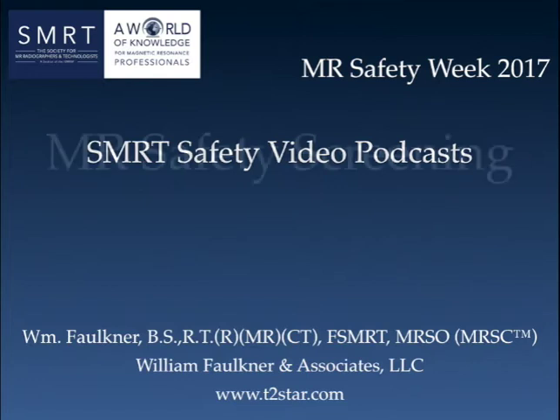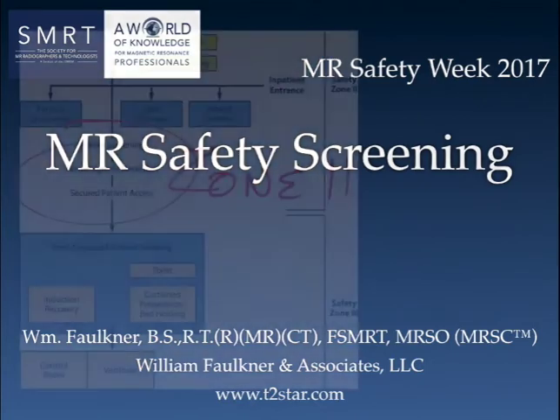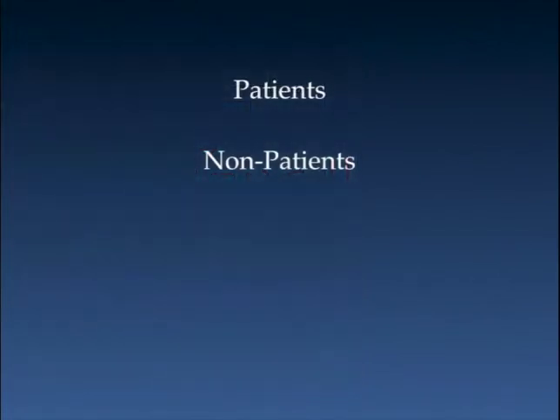For the first one, we're going to talk about MR safety screening. Remember that MR safety screening should occur in Zone 2, that is outside of the MRI environment. And for safety screening, we're going to address both patients as well as non-patients.